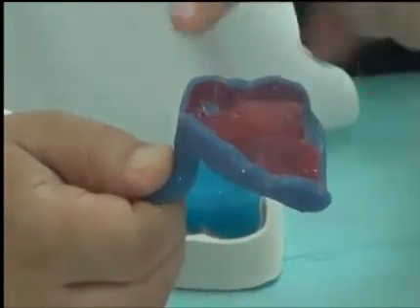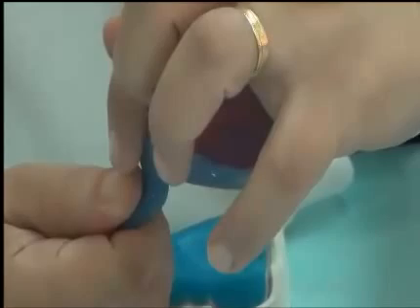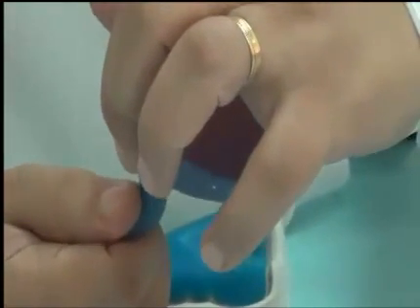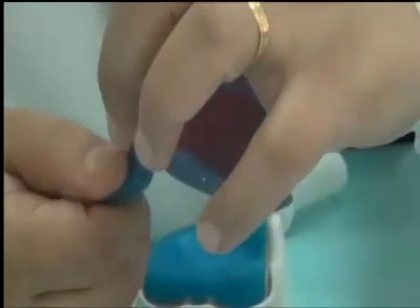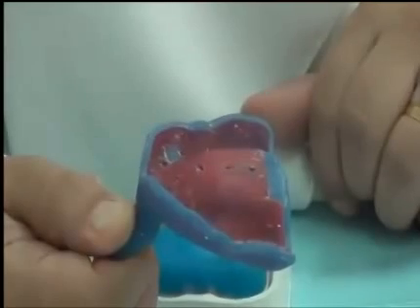So if the lip is inside the patient's mouth and the lip is here, you can notice that the lip will be resting without any distortion or movement. So I can hold my tray, insert it, take it in and out without distorting the lip. So this will aid in an accurate impression as well.